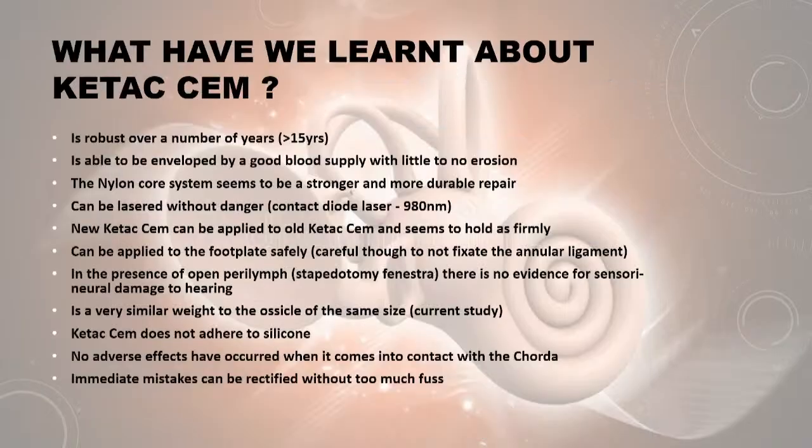So what have we learnt? Well, over 15 years it's robust, and it's managed to stick there. It's able to be enveloped by good blood supply, no erosion. The nylon core system seems to be the stronger and more durable repair.